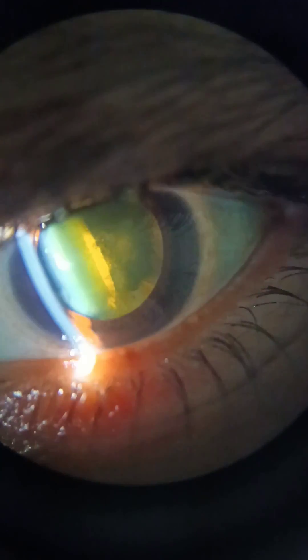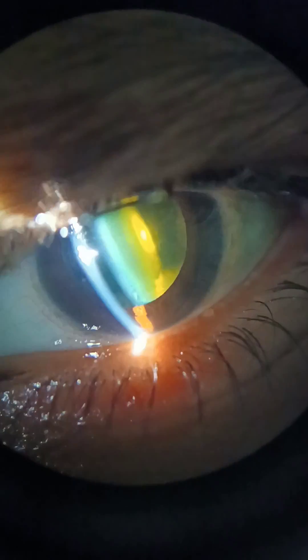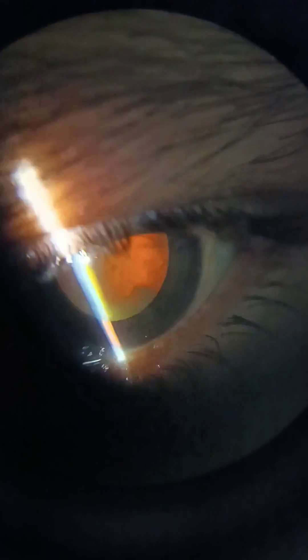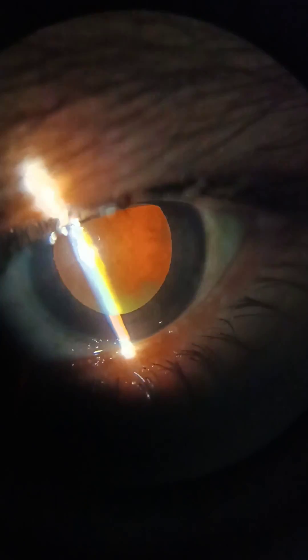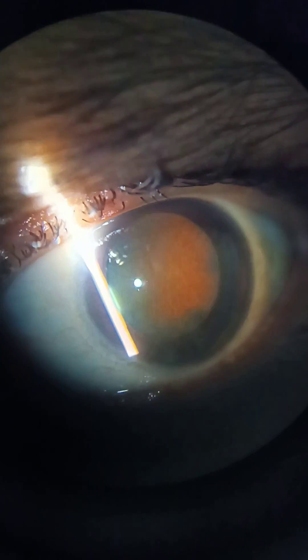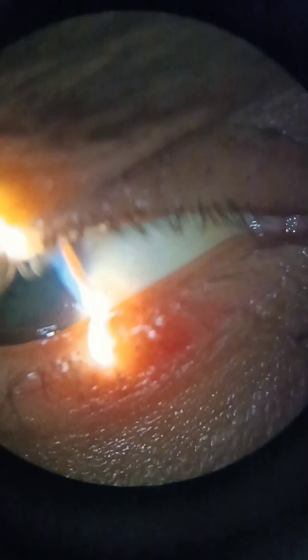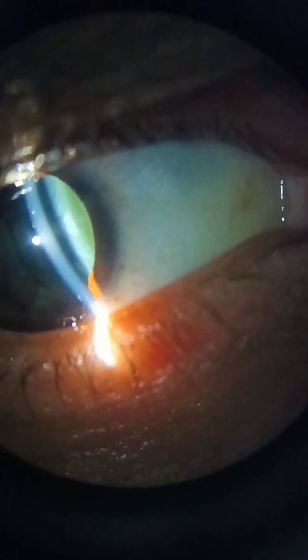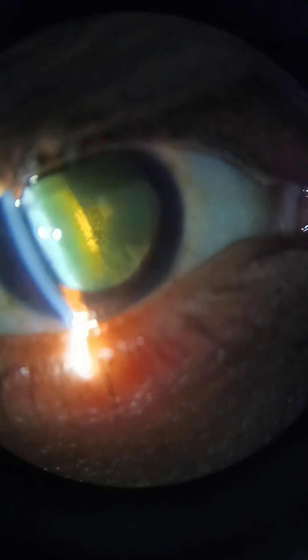The opacity is uniformly spread over the posterior pole, as seen here in the left eye. These cataracts affect vision early because they are centered on the visual axis, leading to visual disturbances in the early period.